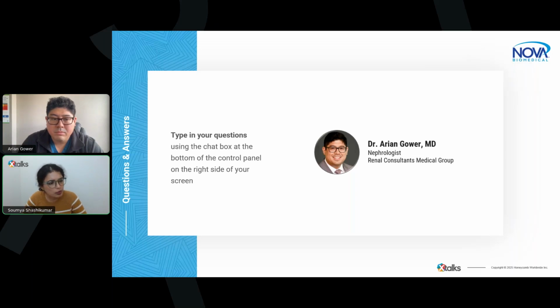Now, the very first question we have here, this audience member wants to know, what are the advantages of using osmometers in-house over other methods for osmolality testing? So I can answer that one. I think the in-house testing gives you timely diagnosis and speed. So having someone in the clinic and trying to evaluate if they have diabetes insipidus, for example, you must have in-house testing. This is not a send out and see what the lab results come back at and then make an adjustment based on that. You really need kind of live testing in order to do that.